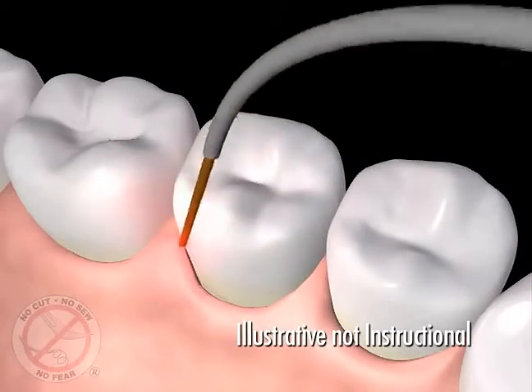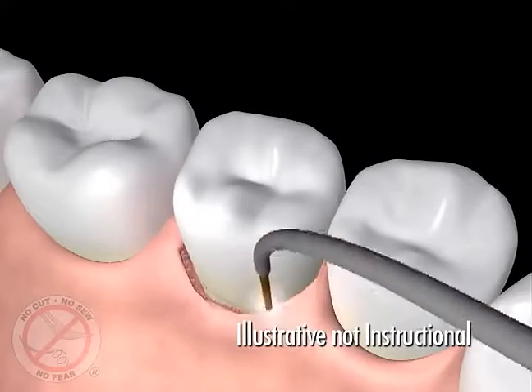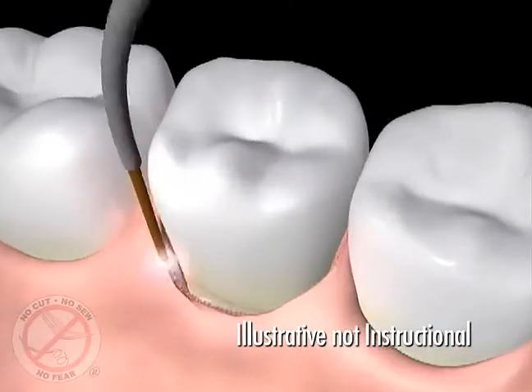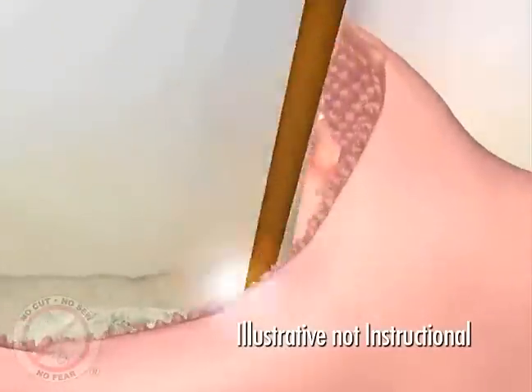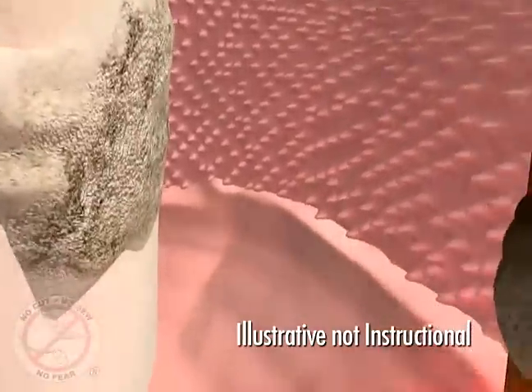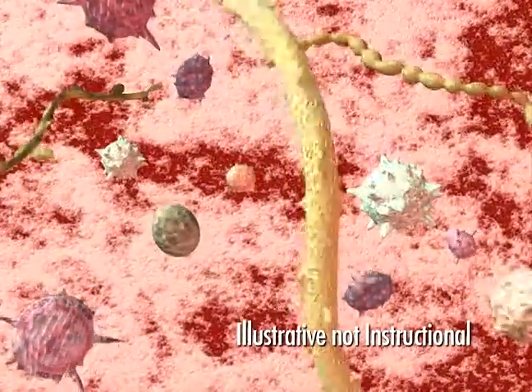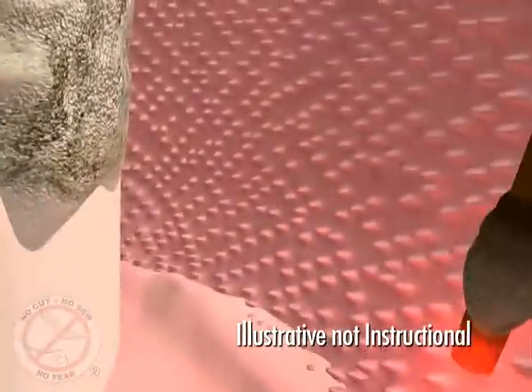The periolase fiber, about the size of three human hairs, is gently placed between the gum and teeth to remove the diseased tissue inside the pocket. This laser fiber selectively removes the diseased tissue and kills the germs that cause gum infections, while leaving healthy tissue unharmed.